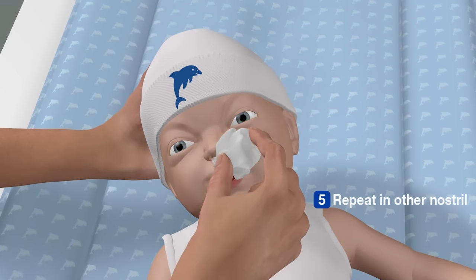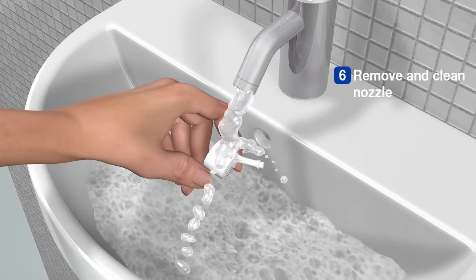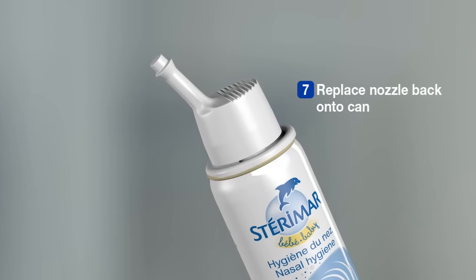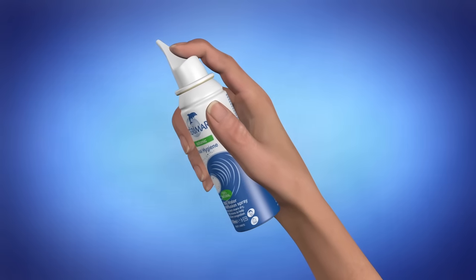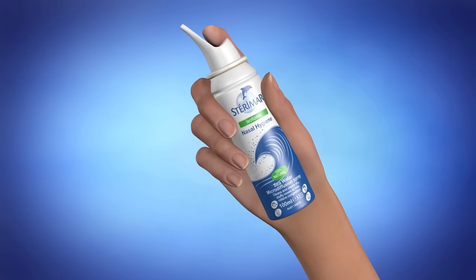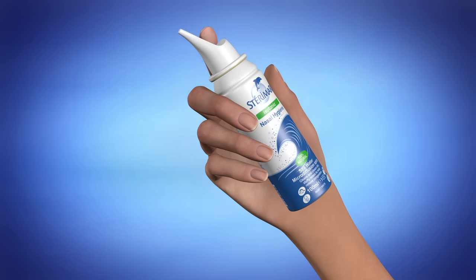Repeat these steps in the other nostril. Remove the nozzle and clean, making sure that you thoroughly rinse it in soapy water before drying and placing it back on the can. By following these simple steps, you can help maintain the wellbeing of your nose and help reduce the onset of nasal problems such as allergies or colds.